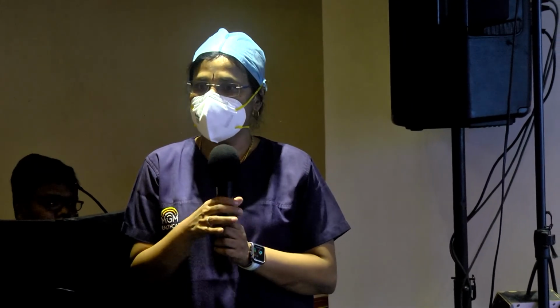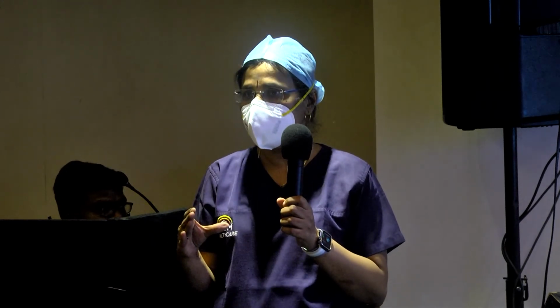So what we do is put an LV vent and connect it to the drainage. The stasis in the LV is taken care of by draining into the drainage site. So you put a bifurcation Y. There will be a femoral venous drainage and there will be a left ventricular apex drainage. That will be bright blood, this will be dark blood. So that solves the problem.